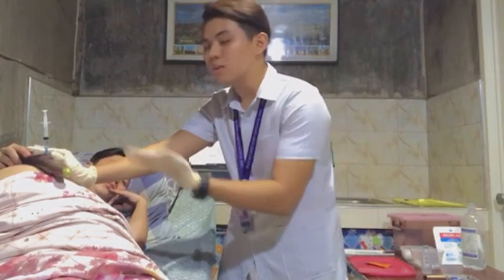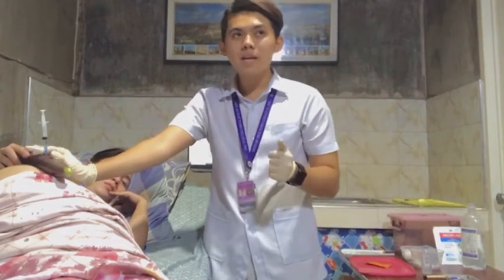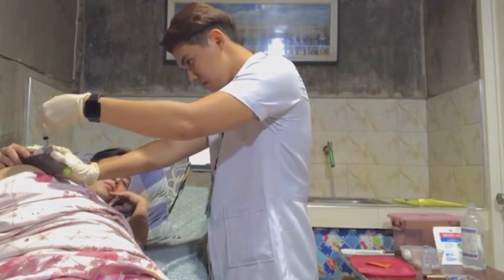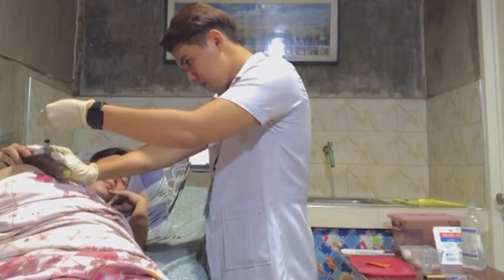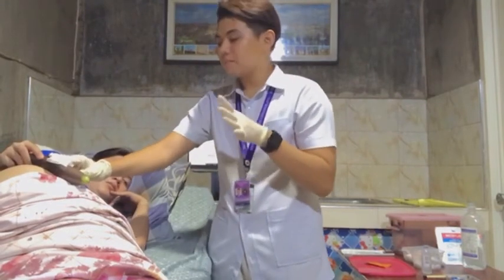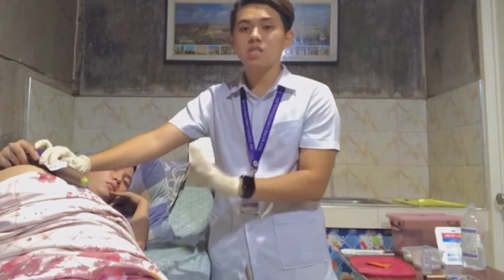We need to inject the medication slowly at the rate of 1 ml in 10 seconds, wait 10 seconds, and smoothly withdraw the needle. And then, take note to apply gentle pressure here and do not massage the area.